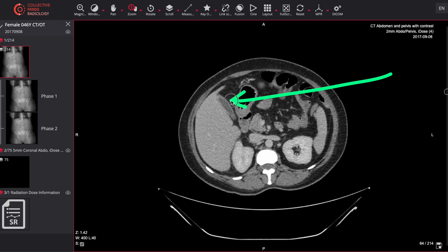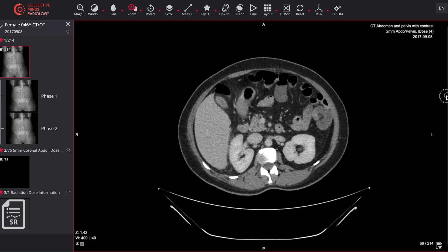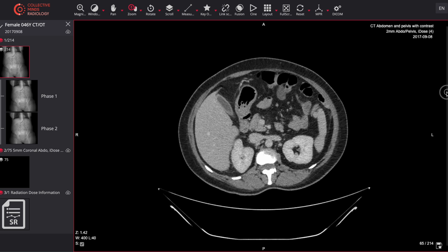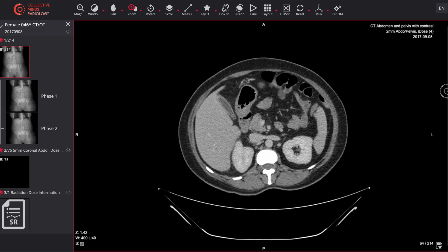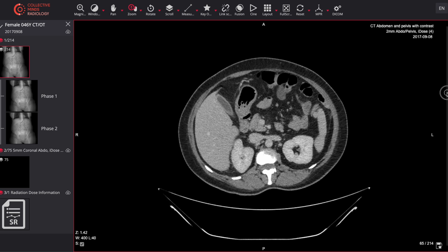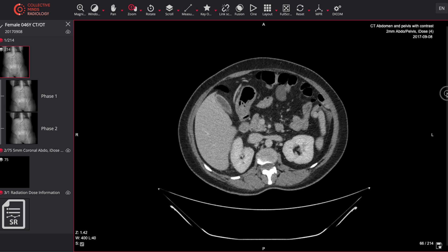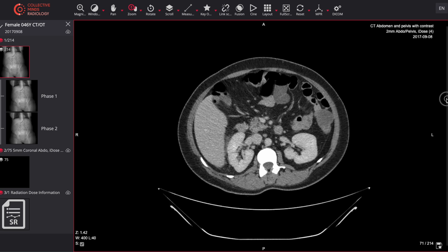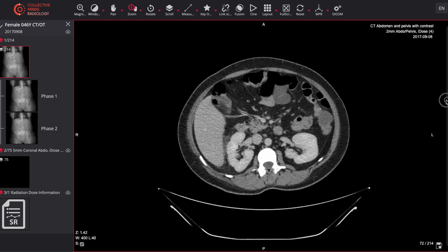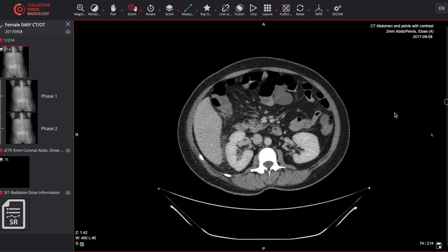Someone with right-sided abdominal pain may have something going on in the gallbladder. The gallbladder is sitting right over here and it actually looks normal. There's no evidence of any fat stranding around there. I'm going to show you what fat stranding looks like in just a second. Right-sided abdominal pain may also be caused by something to do with the kidneys — an obstruction or a calculus of some sort.